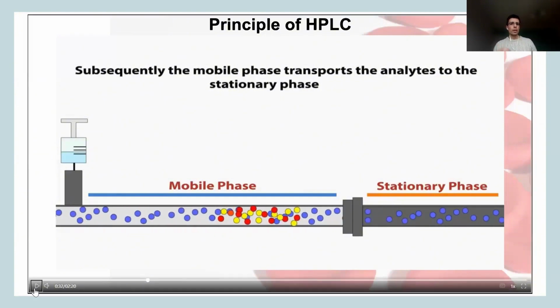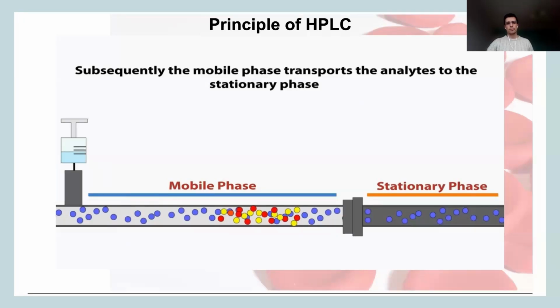The mobile phase is not just used, as the name says, to make the sample or the molecules of interest mobile to the stationary phase. It can also be used to alter the hemoglobin of interest, to make it even more targetable, if I could add that term. When hemoglobin is in contact with the mobile phase of our analyzers, it acquires a net positive charge.